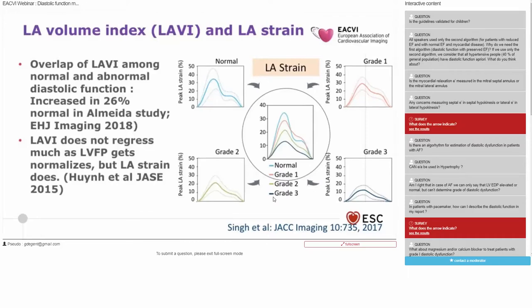And also the LA volume index may not regress after the filling pressure gets normalized, but it was shown that LA strain actually correlates better with the LA filling pressure, LV filling pressures. And also the University of Chicago, Dr. Roberto Lang's lab showed that the LA strain value gradually decreases with the worsening of diastolic dysfunction. So I think we need more clinical validation and more experience to use LA strain, but it appears to be quite promising for future assessment of the diastolic function.